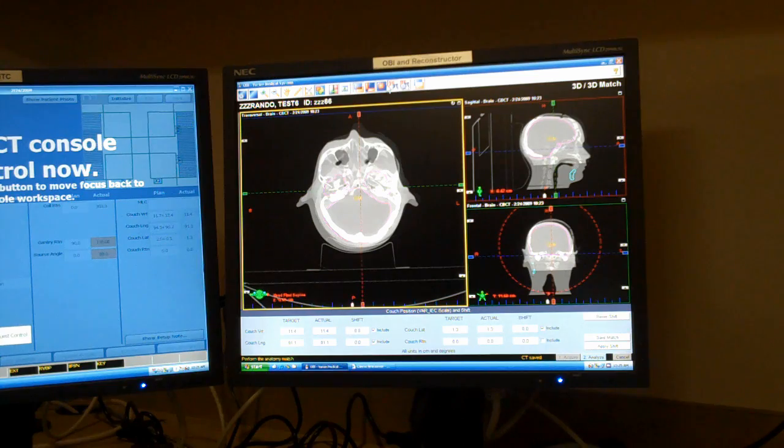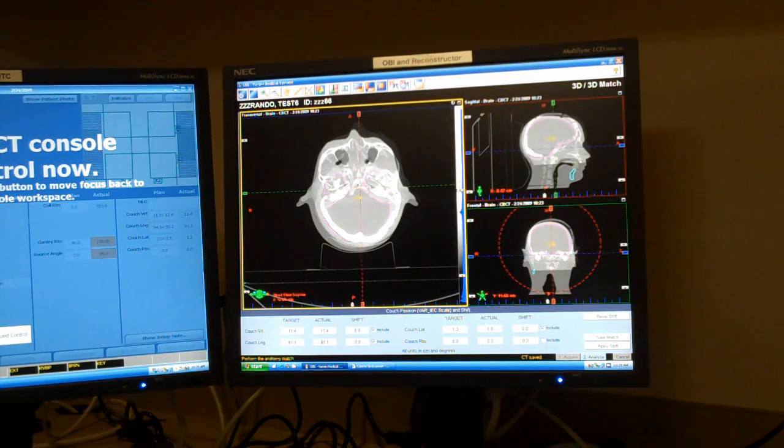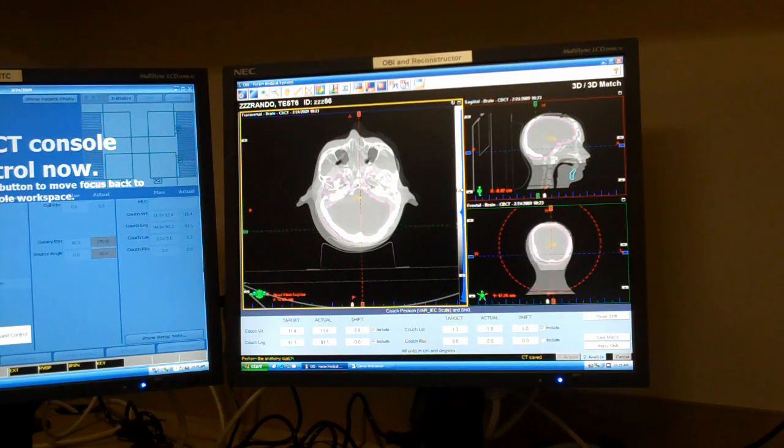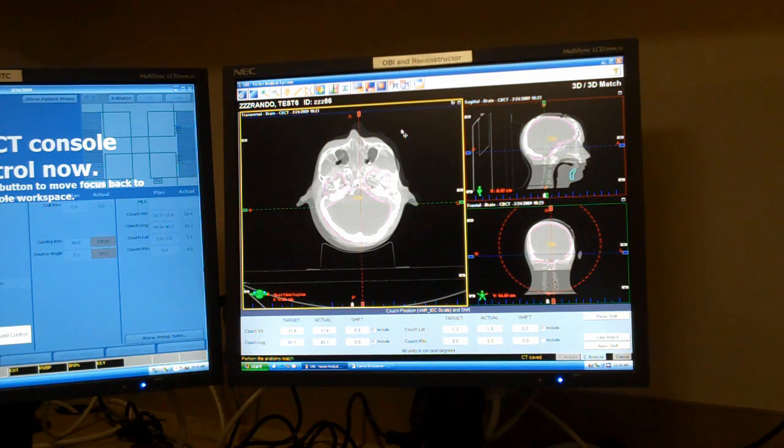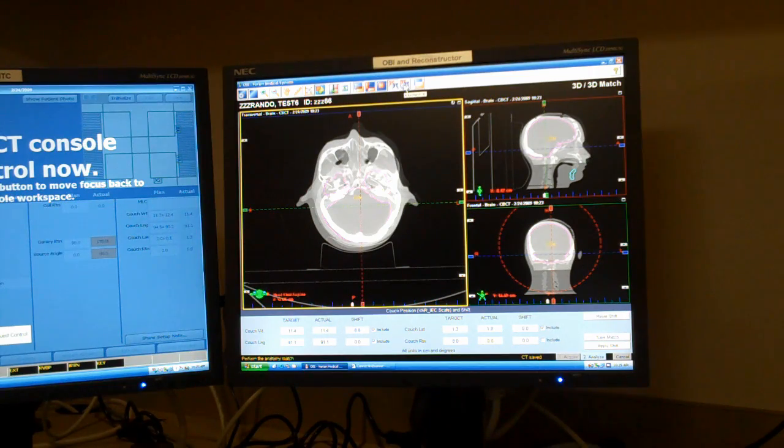So this is the window that pops up immediately. We can change the slice we're on and all three views. Obviously, you can change views very easily.